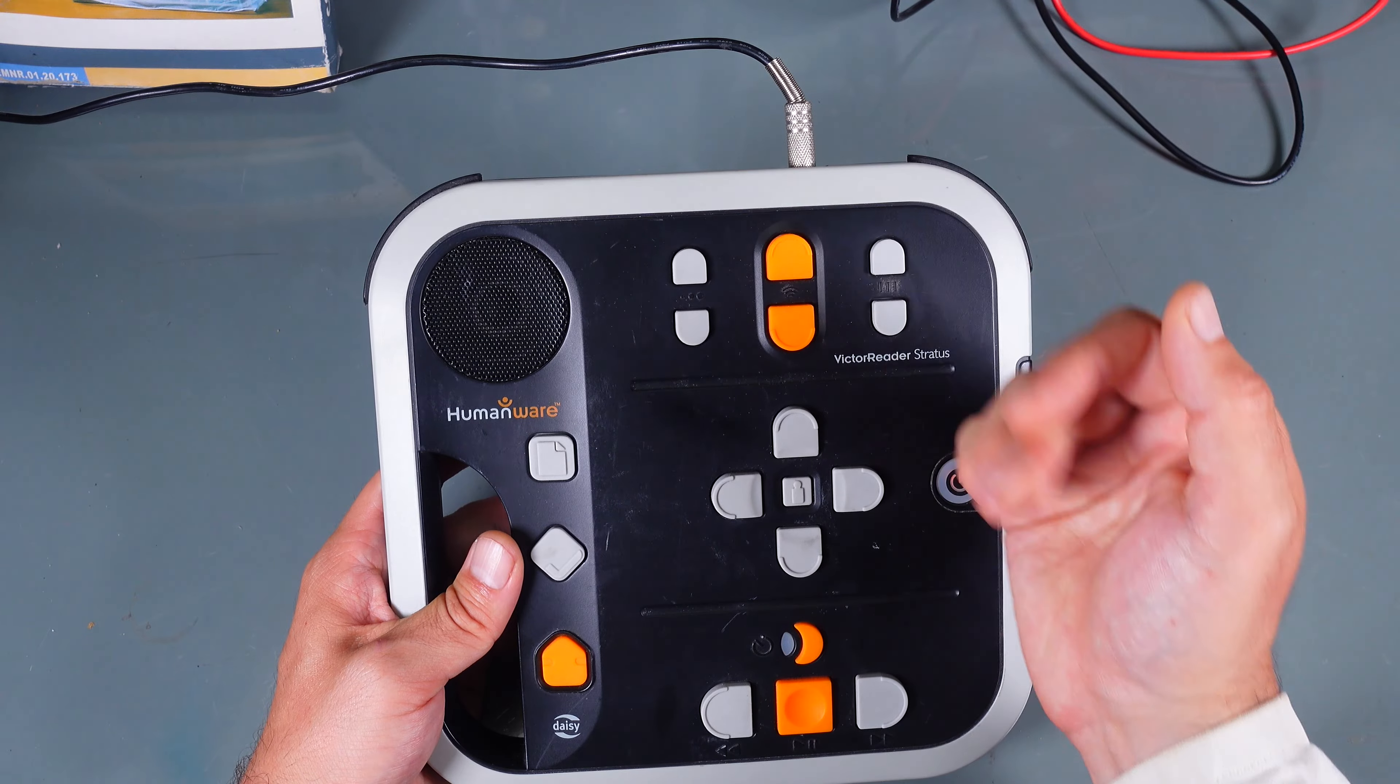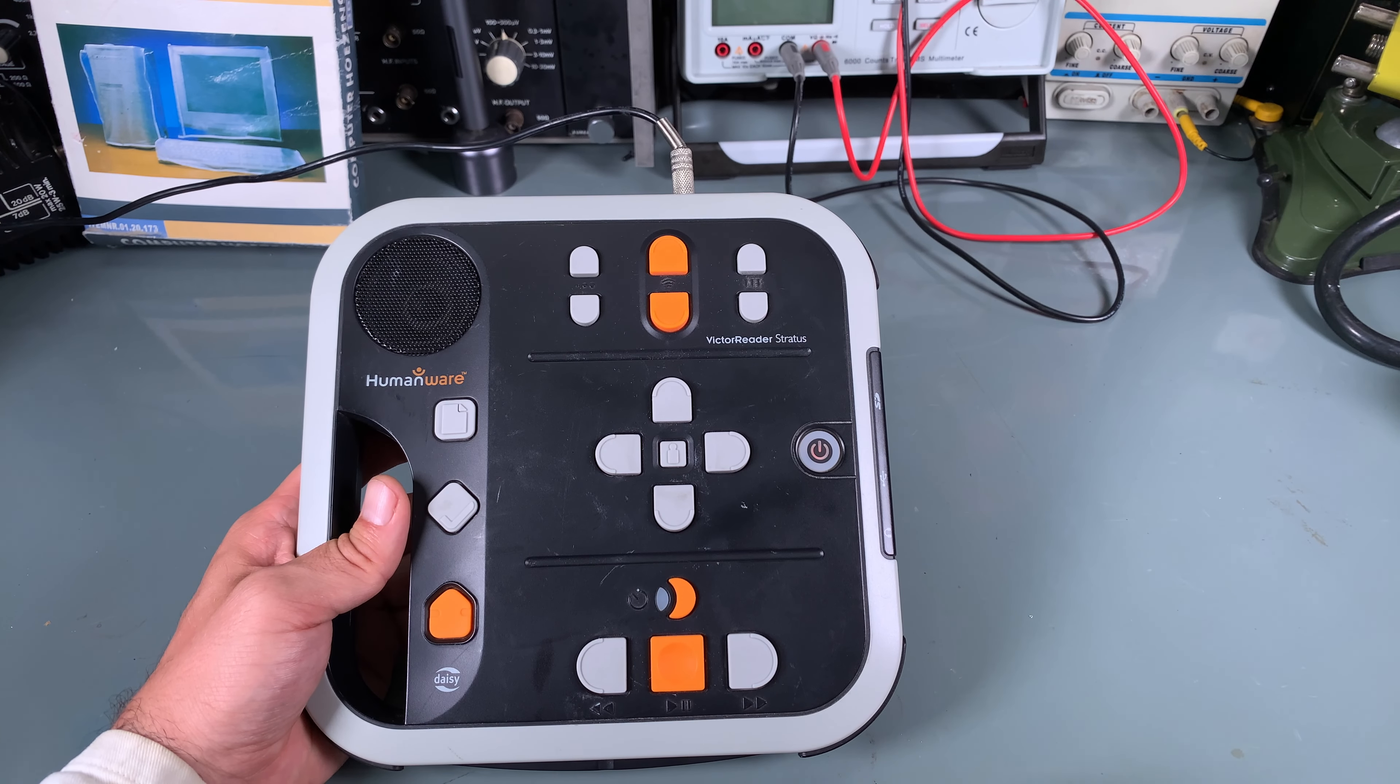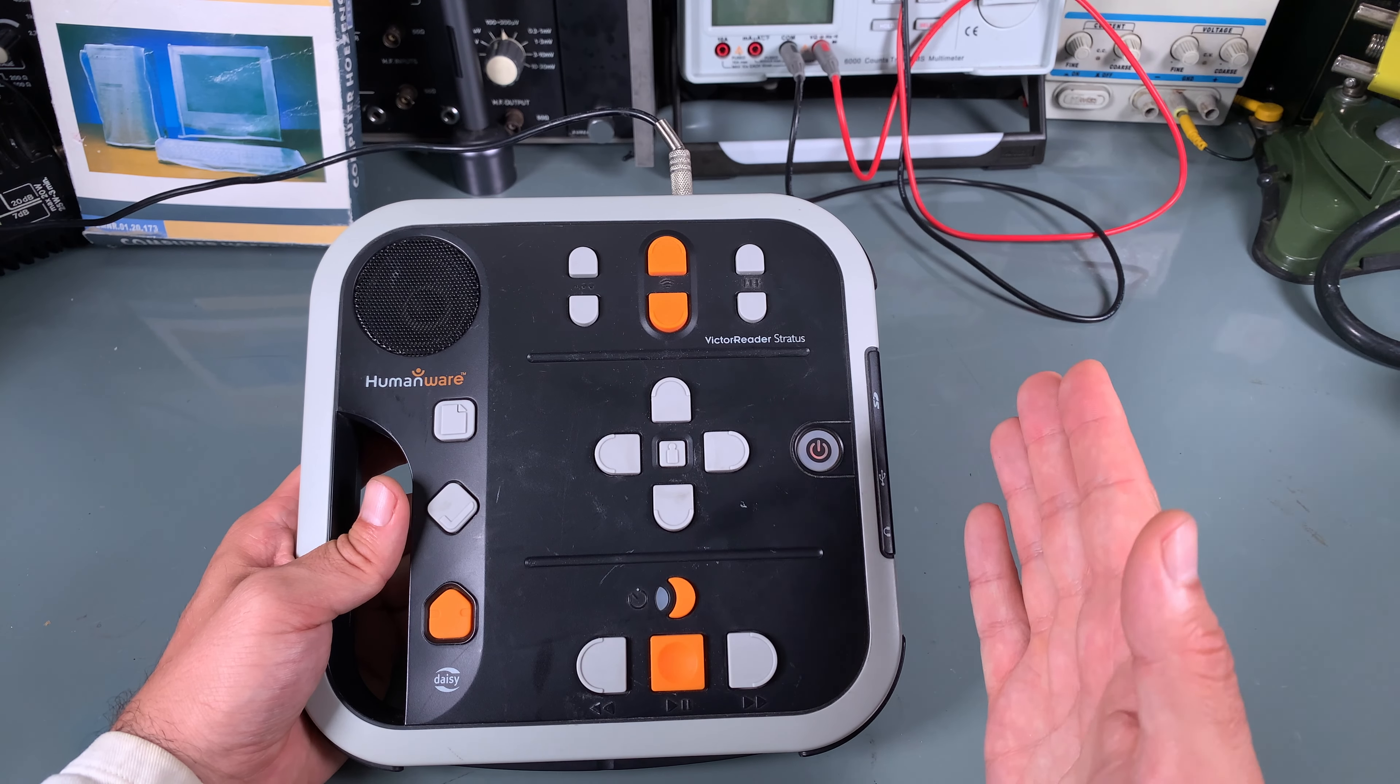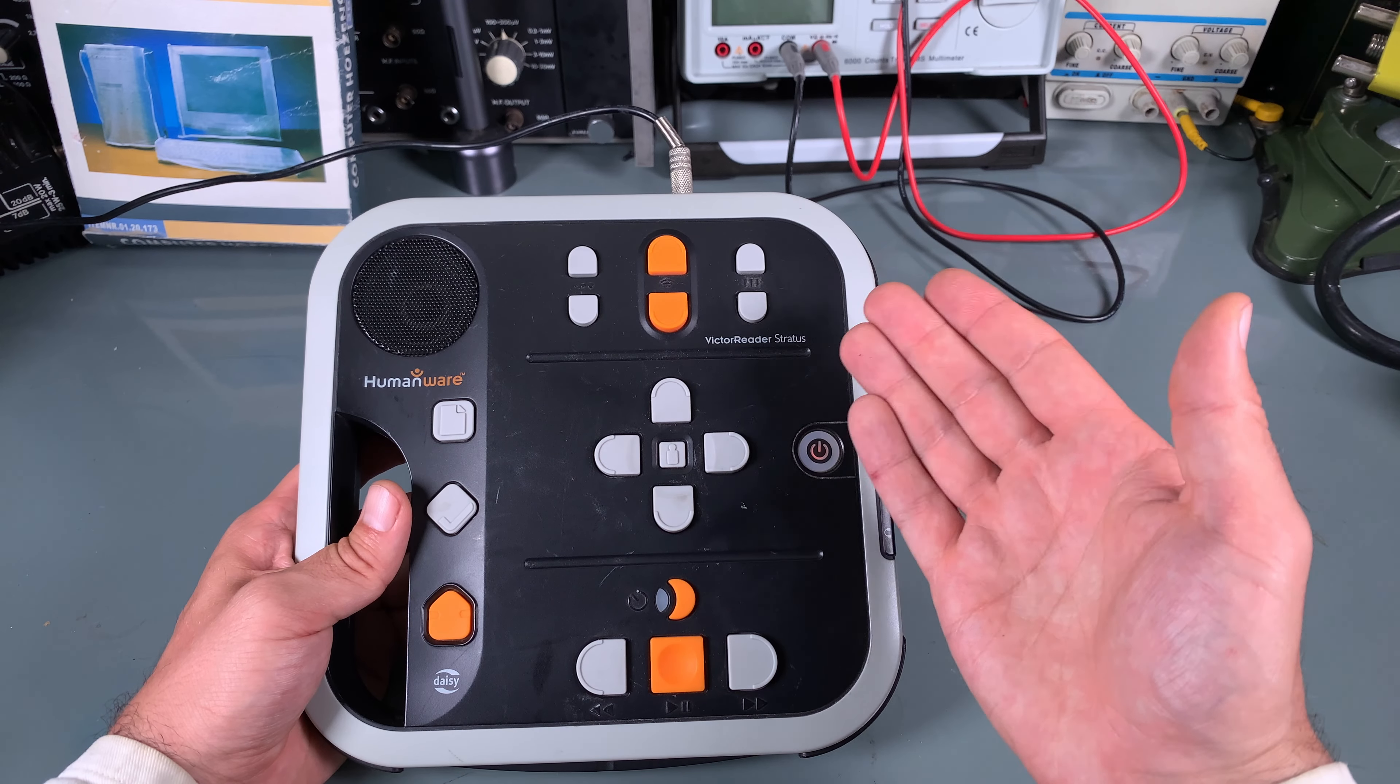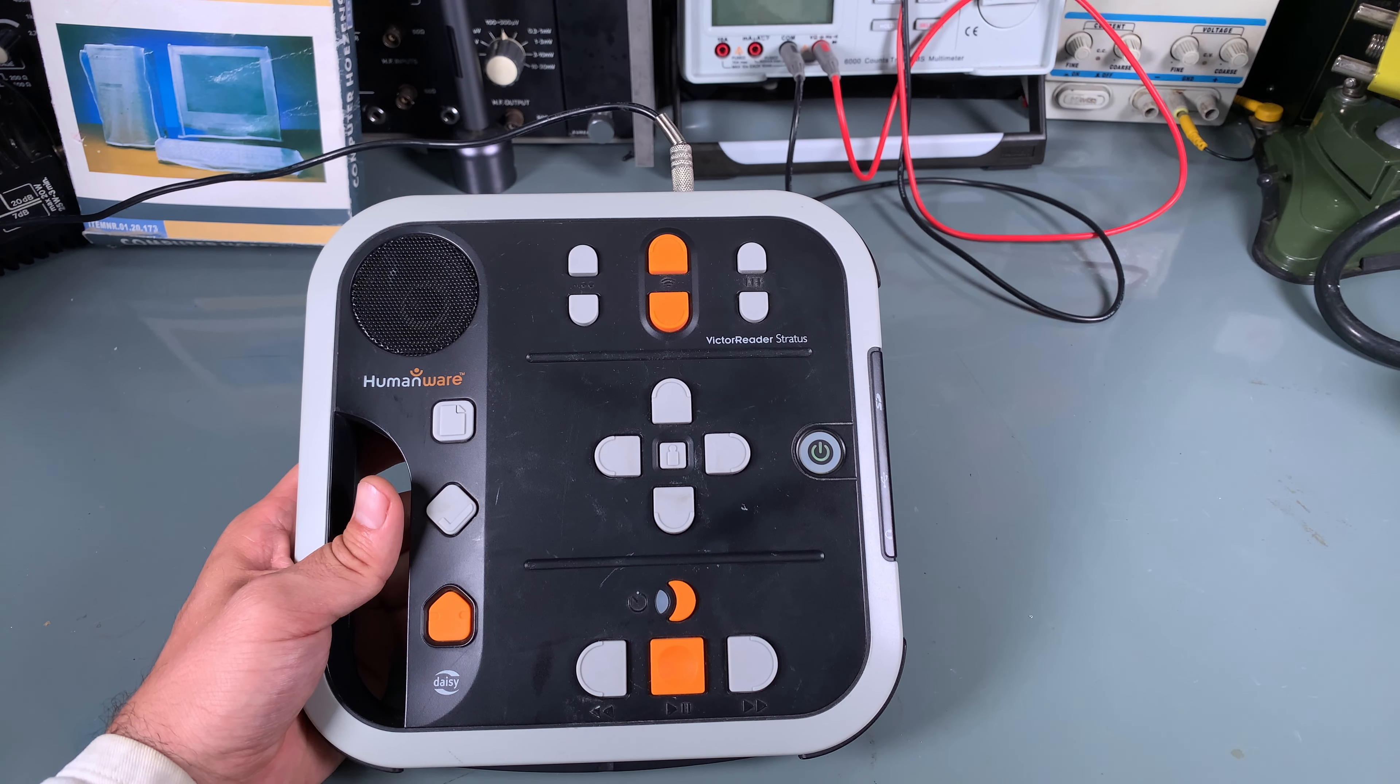You've got a DC input. Inside on the back there is a battery. Here we've got a speaker and lots of buttons designed for control. As you can see, they've got a distinctive feel and location so you can learn which button does what. They also announce what they're dedicated to do. Let's power it on and it's going to say hello.